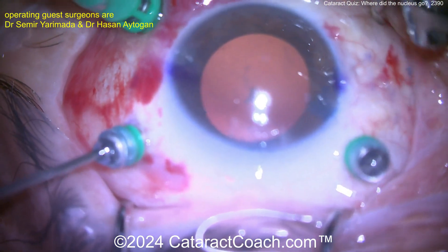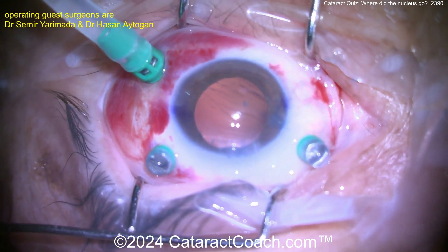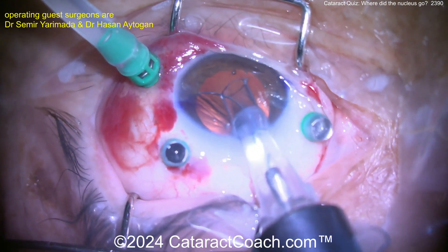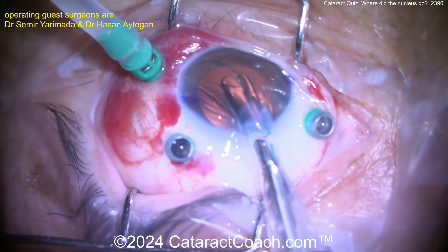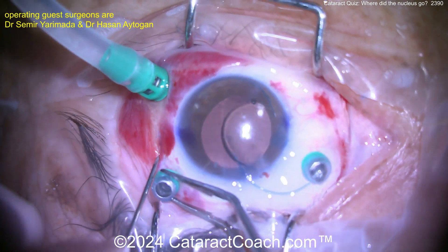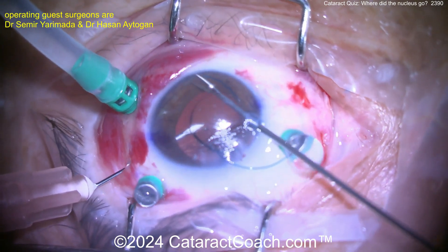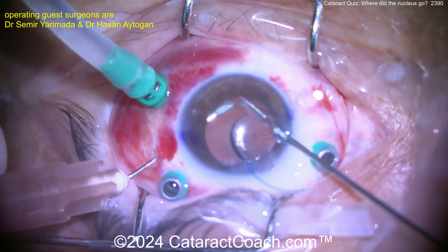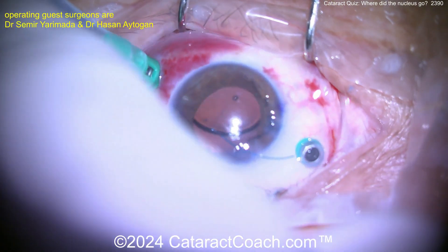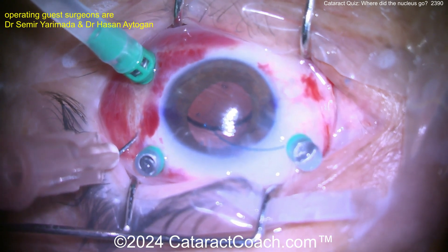This is what happens when I don't do vitrectomies — we'll have a retina channel coming to CataractCoach, it's going to be retinarounds.com. Now here we go with the Yamane procedure. This Yamane is going to be a lot more straightforward because you have a full vitrectomy already completed. Threading the haptic through and then pulling it out, then threading the other side as well.